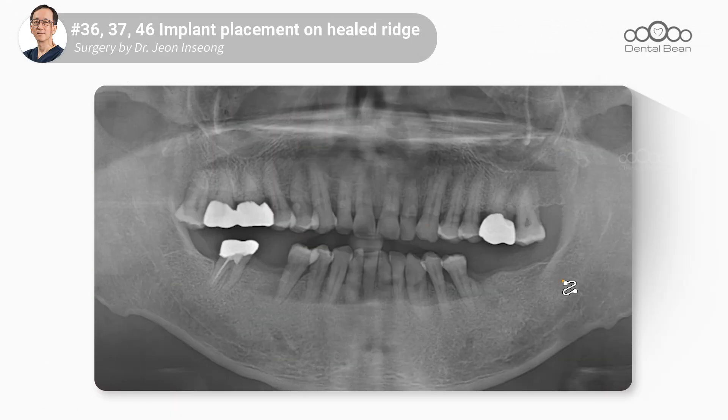Hello, this is Dr. John Insong from DentalBean. Today's patient is a 68-year-old male patient. The reason for his visit is that the 46, 36, and 37 teeth were extracted a long time ago. Today, one implant will be placed on one side of the mandible and two implants on the other. Since there are no issues with the inter-arch distance, I believe there is no need to grind bones to increase it.